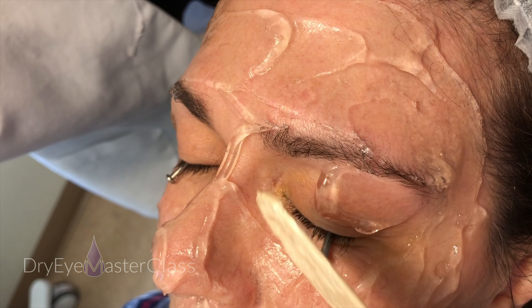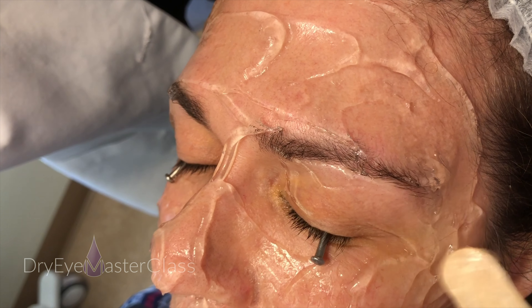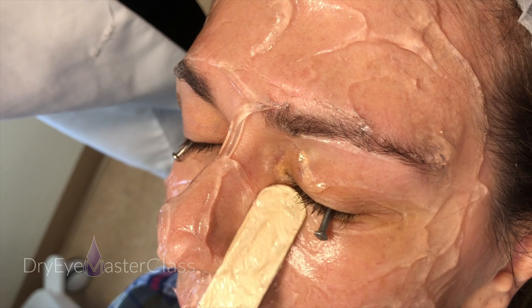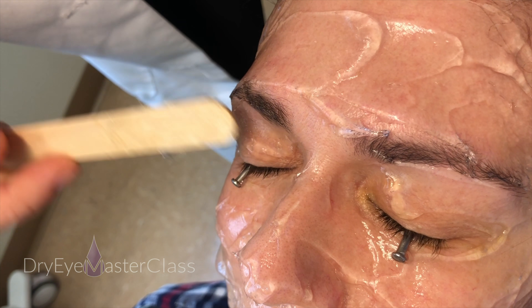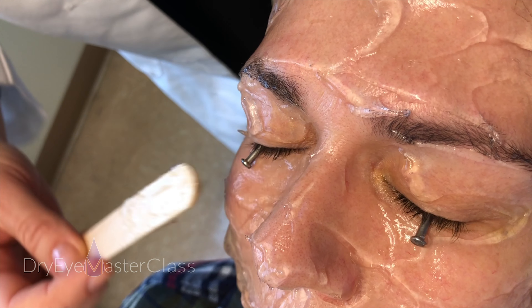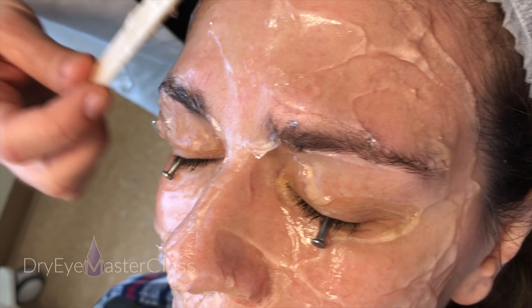You want to get the gel on the lids but not too close to the lash line, for a couple of reasons. If the gel gets into the eye it can be pretty irritating for a day or two — patients will report a gritty sensation. So you need it close enough to get the light energy there, but not so close that it actually gets into the eye.